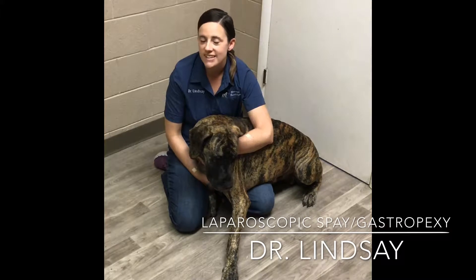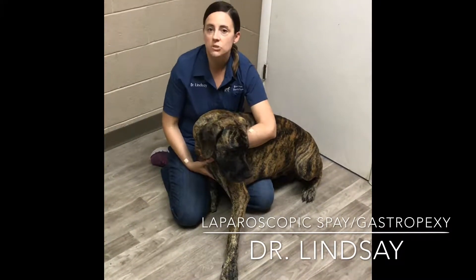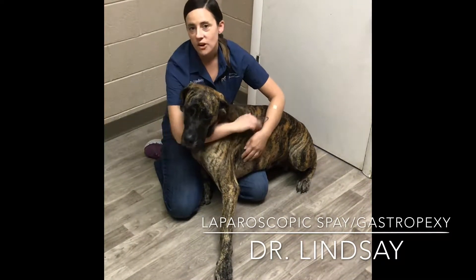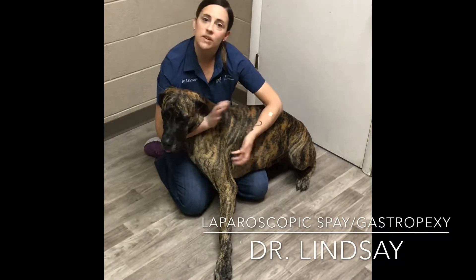Most of you know what a spay is, but a gastropexy is actually a procedure where we tack the side of the stomach to her abdominal wall. Big dogs like Scout have a risk of actually flipping their stomach.